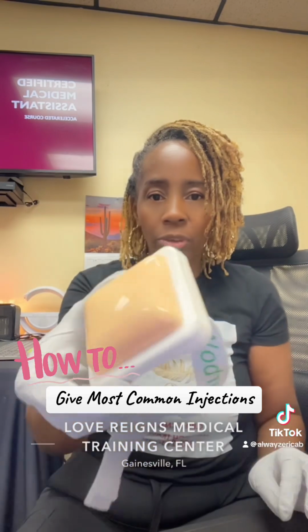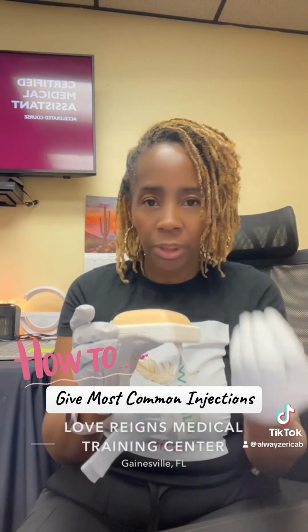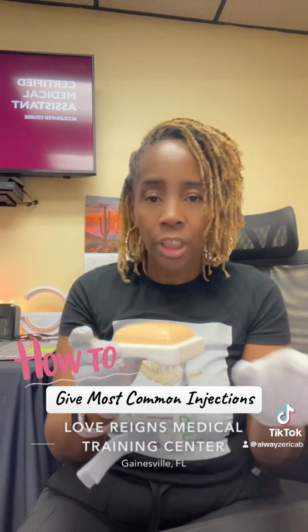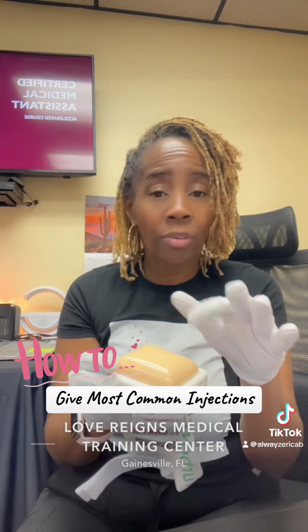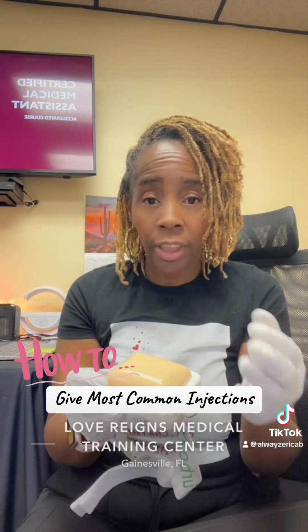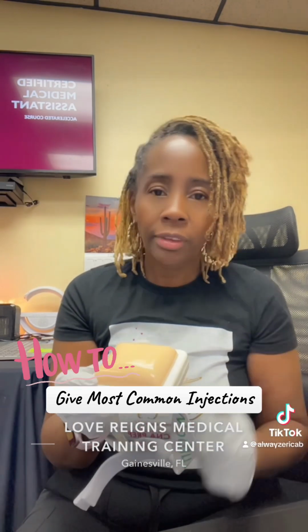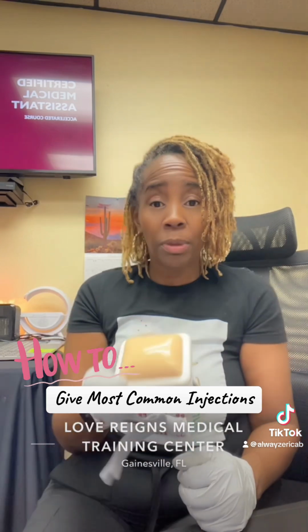That makes sense? We will clean that site. This person will be coming back within 72 hours, so we can look. What should happen is that bubble, the wheal, should dissipate back into the tissues without any issues. On occasion, somebody might have a reaction, meaning some swelling or redness, some bumps, whatever could pop up. Then this person may have had a reaction to the antigen, and they're going to need to have a chest X-ray, and they're going to need a chest X-ray going forward every time they ever need a PPD.